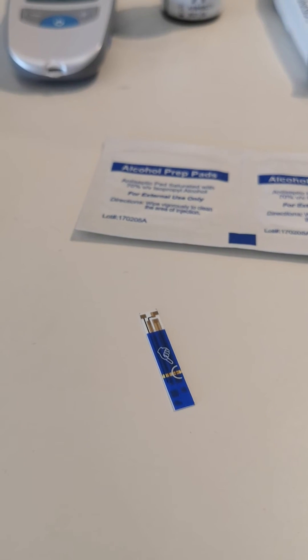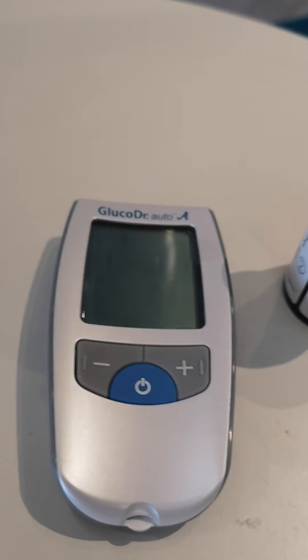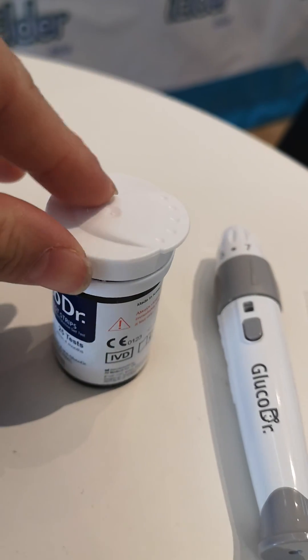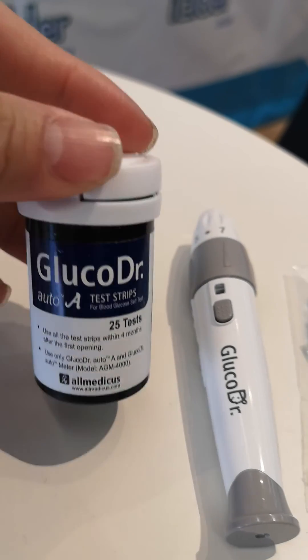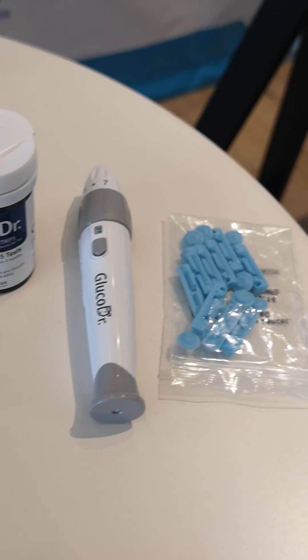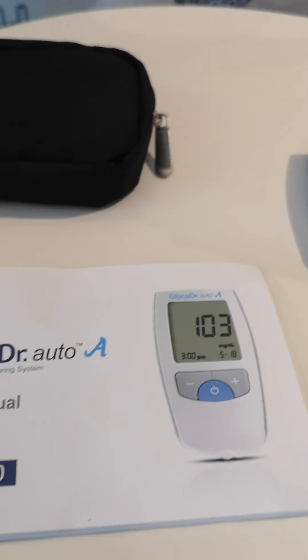It also has a wide hematocrit range, meaning that all patients — regardless of gender, age, pregnant, on dialysis, as well as anemia patients — can use this meter without any difficulty. This brand is from Korea, by a company called All Medicus.